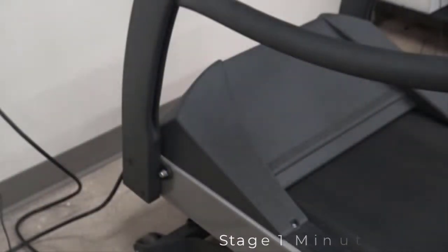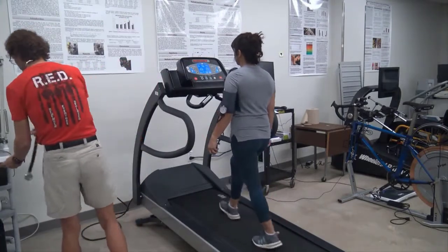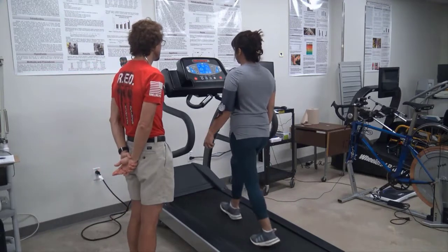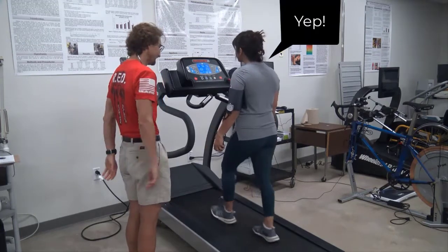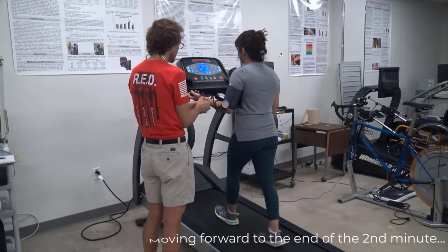When conducting an exercise test, be sure to communicate with the clients and ask them how they are feeling. One thing to be sure to avoid is any kind of leading questions — for example, 'Are your legs burning yet?' or 'Are you tired?' Ask them how they are feeling and if they are okay. You also have the rating of perceived exertion scale at the end of each stage to get an idea of how tired they are.